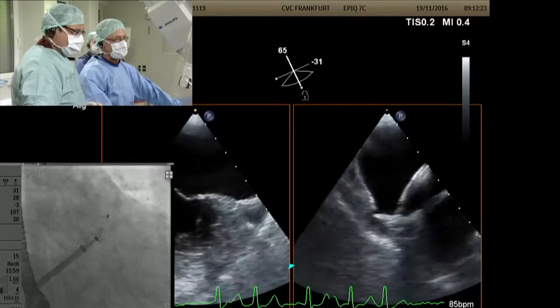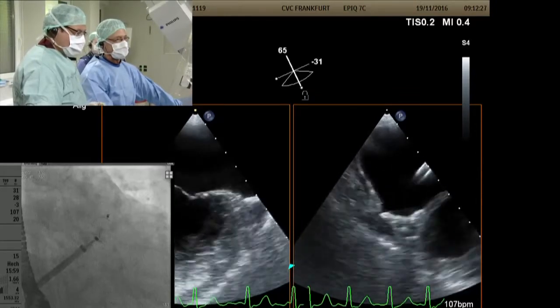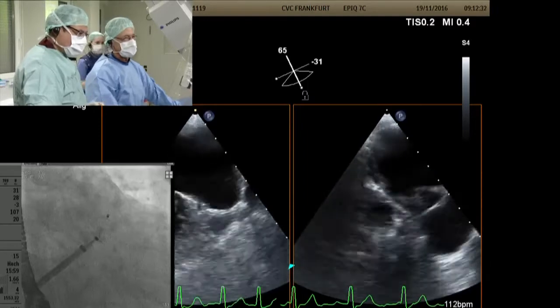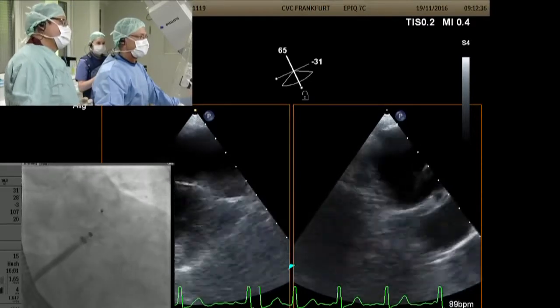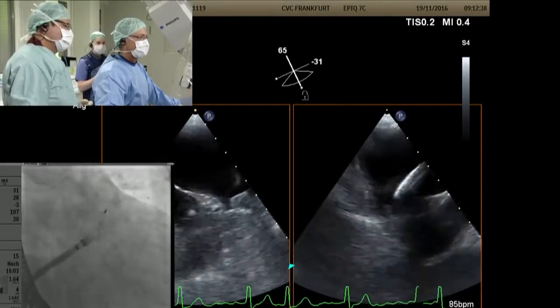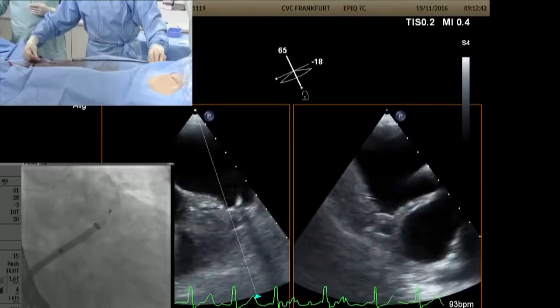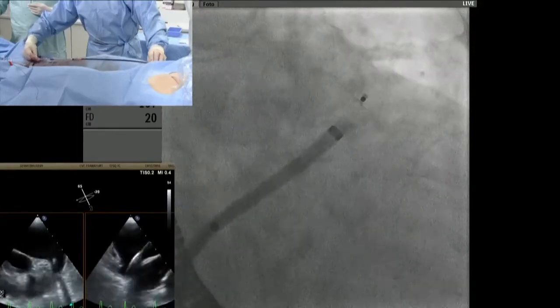I don't think so, Matt. And the point that it is 5 millimeter, 3 millimeter, or 6 millimeter is not the issue to me. It is the fact that there is an uncovered lobe. Okay, Matt. I think there is a difference between a residual leak with a Watchman and leaving the lobe partially uncovered. There's a difference. So here, this would not be acceptable for a Watchman result. All right, Horst, what are you going to do then?